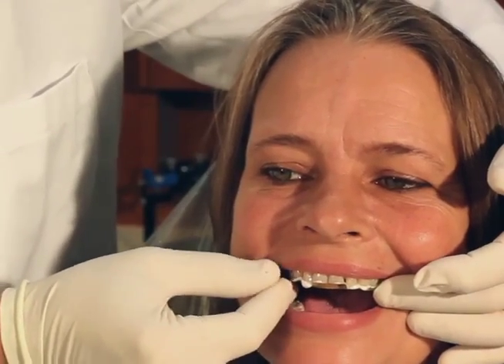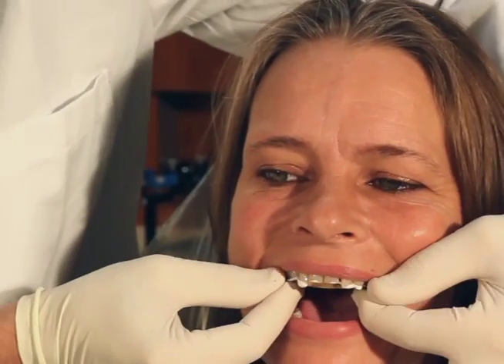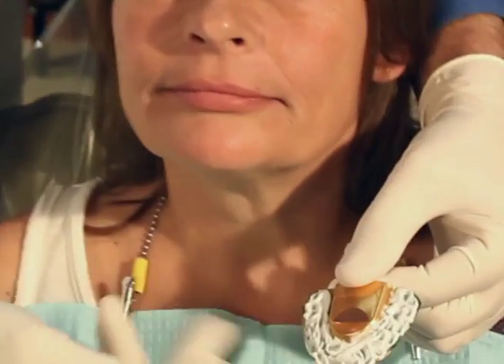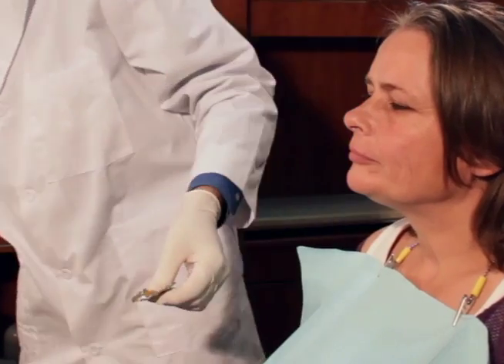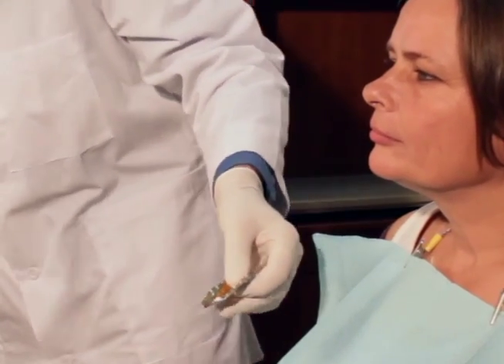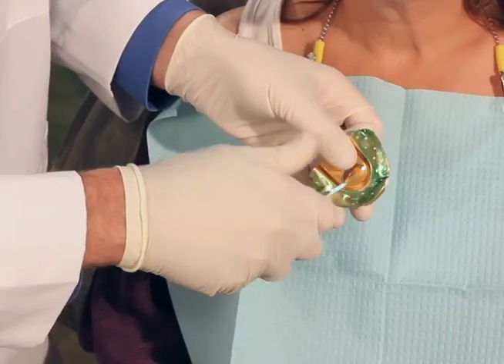Put your finger underneath here and on the side, then just kind of shake to help break it loose. Now we can see we have registration of the maxillary teeth to the bite tray. We can now dry the lower side of the tray in preparation for the compound. If any material has oozed through the holes on the tray, we can take a little lab knife and cut these little nodules away.